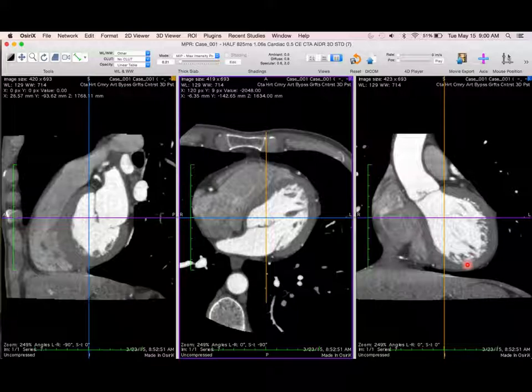So that gives you another engineering problem: we've got all this data, and we're expected to find all this stuff from it. How do you do that in an efficient way? Do you get robots to do it? Do you get lower paid personnel to drive through that data and create presentations, such that the high paid physician who's going to make the call and sign off on the report, the person responsible for it, can look at it and have absolute confidence that they're right in saying, yeah, this person should go to the cath lab, or no, this person's normal?